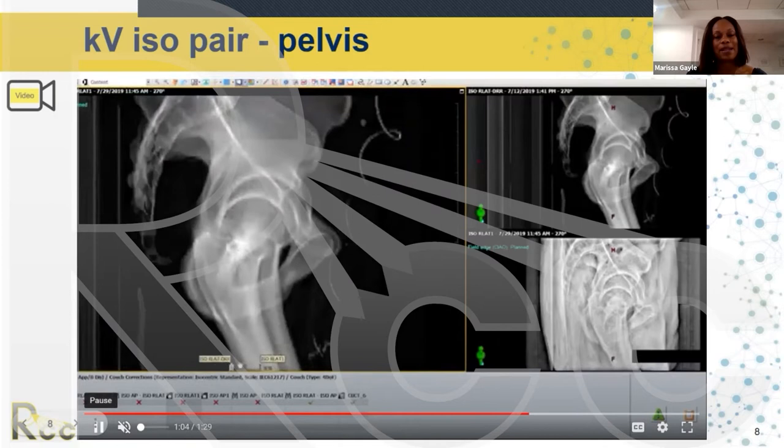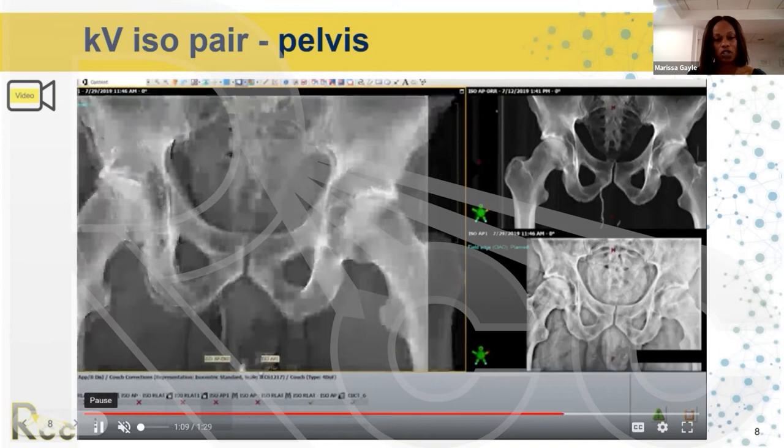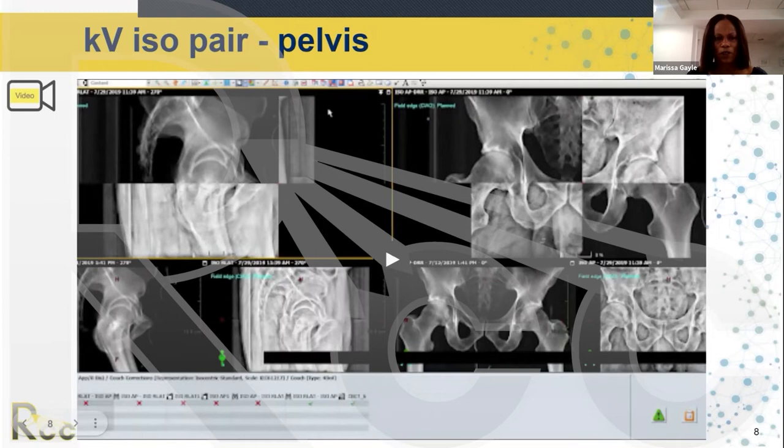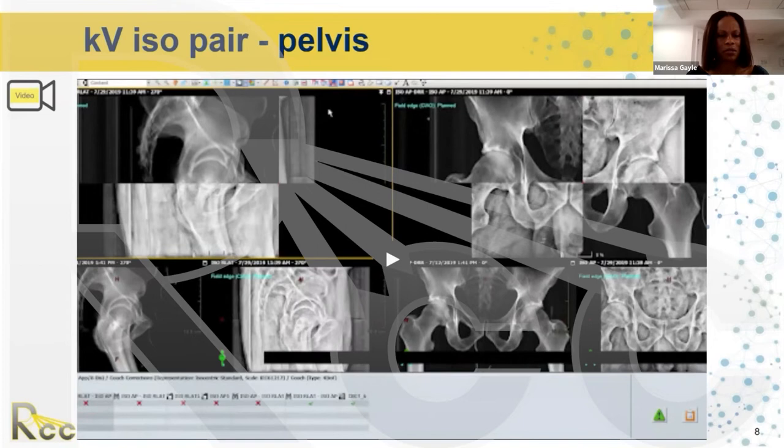On the AP, the hip on the right side is higher — we would need to bring that hip down. This imaging came from Joshua. We'll play it one more time to confirm where the rotation was, and later we'll discuss how to fix these rotations. Feel free to put questions in the chat.